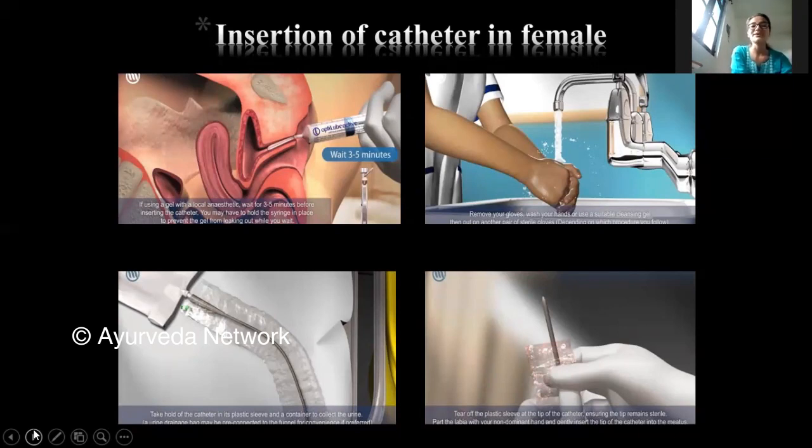After performing this, again, this is also very important. After you have touched these articles, it is very important that before you do any process, you are again washing your hands, because anyhow we have to avoid infection. And after you ensure that your catheter is connected to a urobag, you should start the procedure.